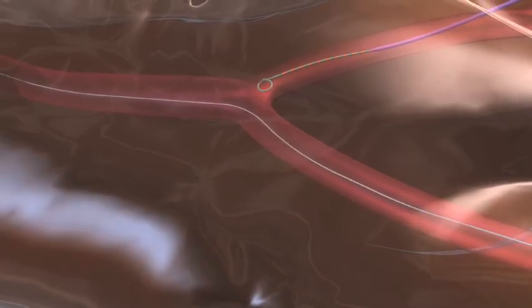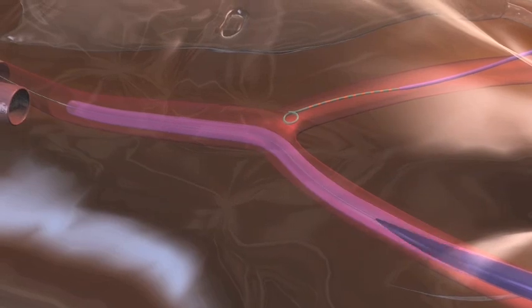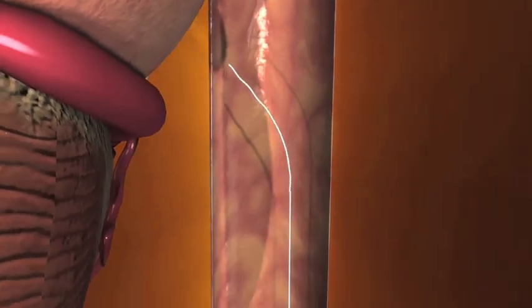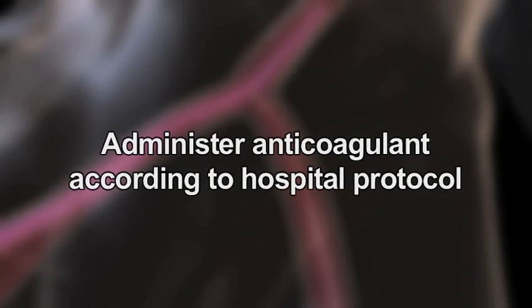Exchange 9 French introducer for an 18 French introducer. Remove super stiff guide wire. Administer anticoagulant according to hospital protocol.